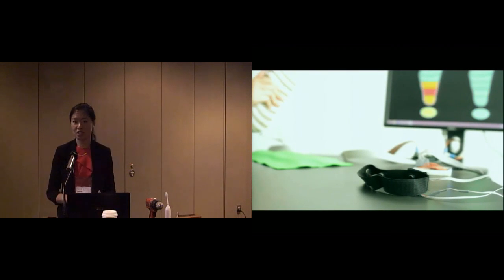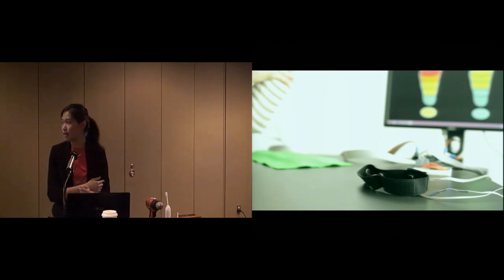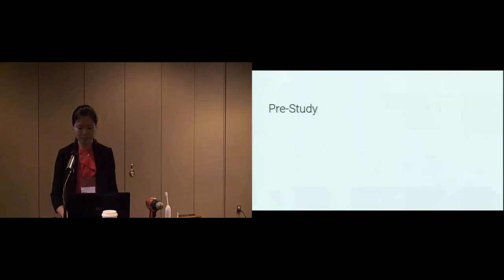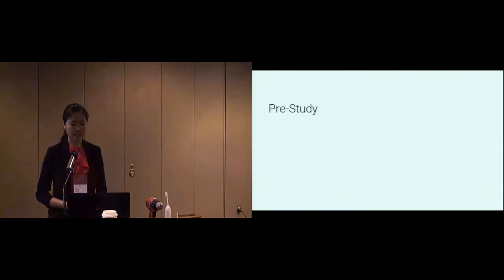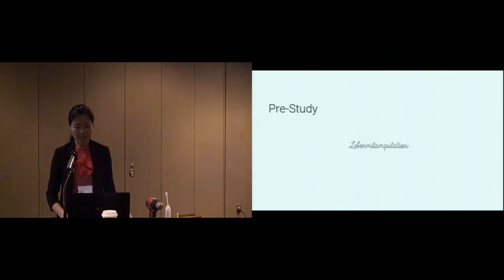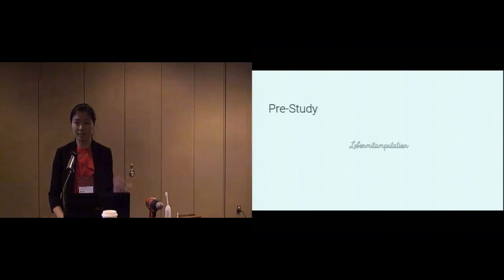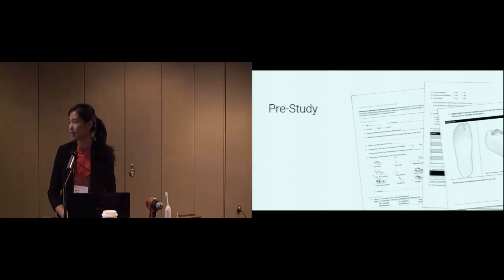We use this information to drive a vibration feedback armband, and this band can actually also be worn on different parts of the body, so not restricted to the upper arm, but can also be worn, for example, on the upper leg. So after we prototyped this, we really wanted to understand how best to design the system for amputees. And we had the fortune of working with a local support group for amputees called Leben mit Amputation. And what we did is we issued them a questionnaire.